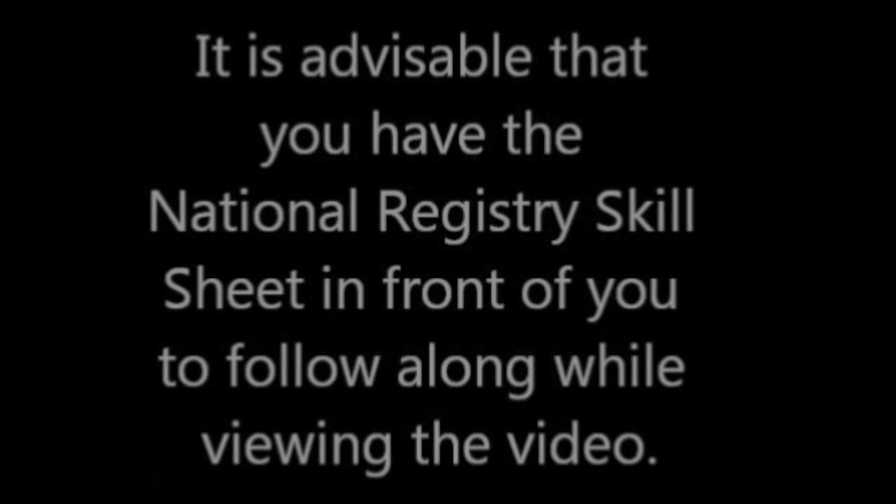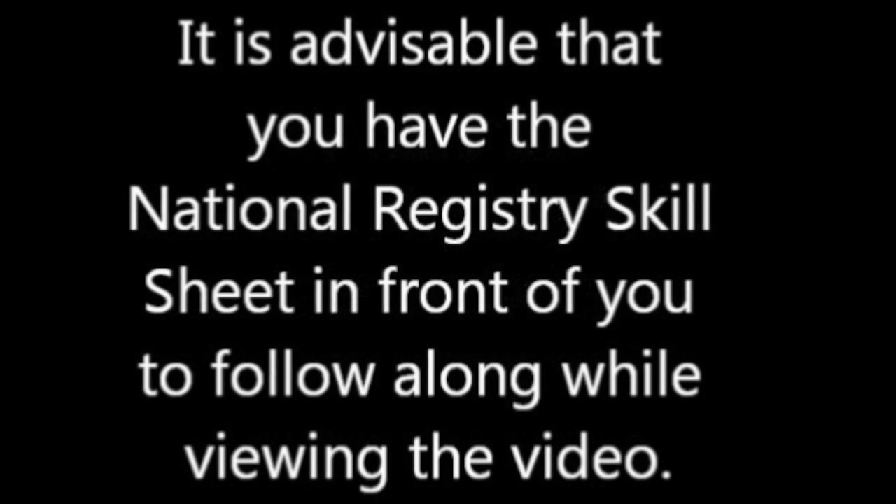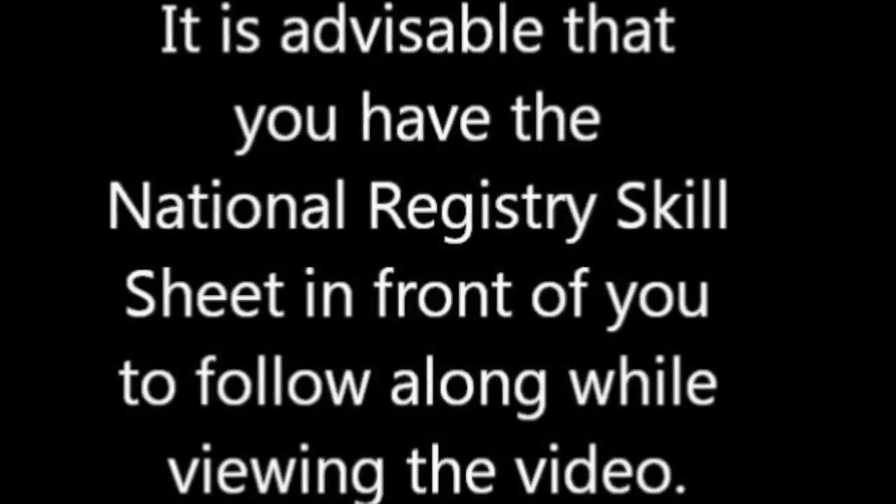The following is a demonstration of the bag-valve mask ventilation of an adult patient. The demonstration will be performed as a candidate would be expected to perform during the cadet qualification skills exam. This skill is designed to evaluate your ability to provide immediate and aggressive ventilatory assistance to an apneic adult patient who has no other associated injuries.